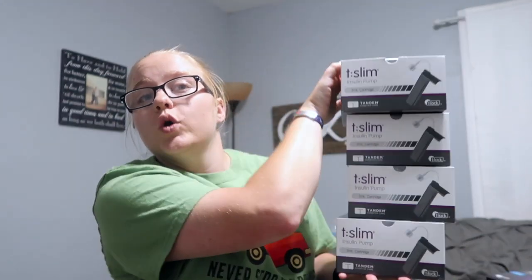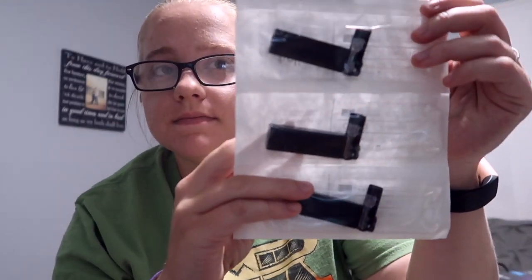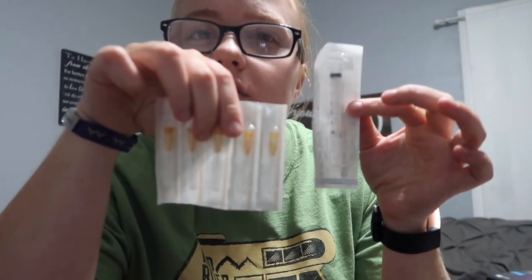The next thing you get are your cartridge sets — there's four boxes. What's in this box is the cartridges and everything you need to fill your cartridge, including your syringe and your needles. With the T-Slim pump, you change your infusion set every three days. You fill your insulin into the cartridge and change your infusion set one time every three days.